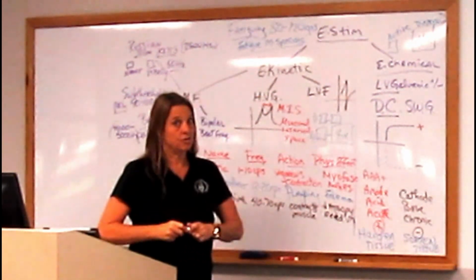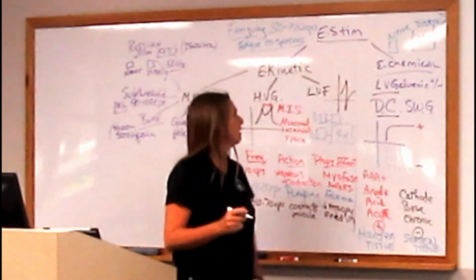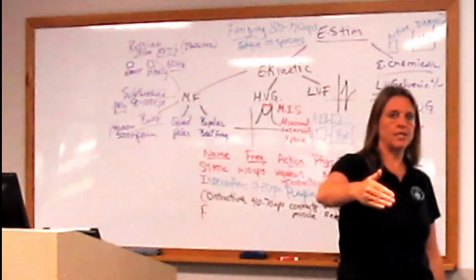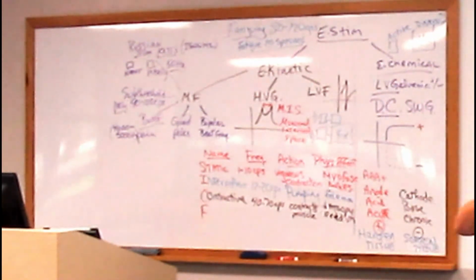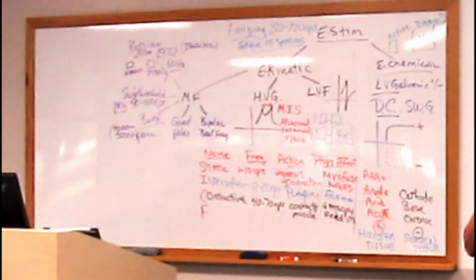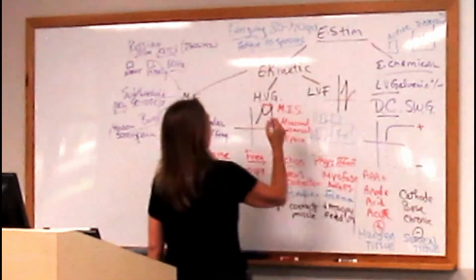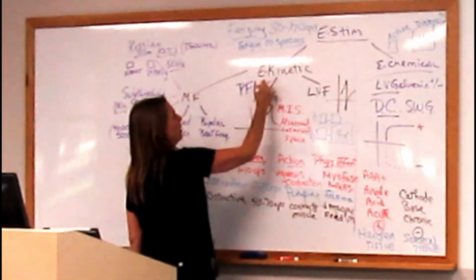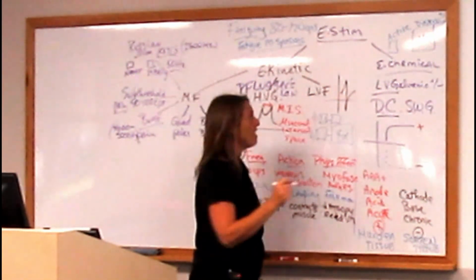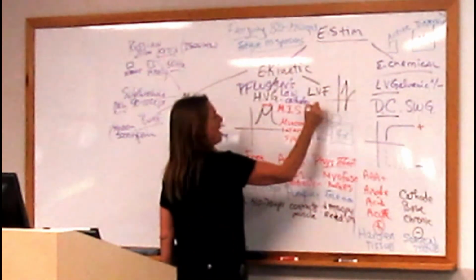The last message to remember, though, is high volt is really strange. High volt galvanic does seem to have a better contraction potential if you set the active pad to negative. And the man who named this was Dr. Pfluger. Hard to spell, so I'm going to write it big, Pflugger. Pfluger's law says use the cathode. So it's cathode for action, for active pad.